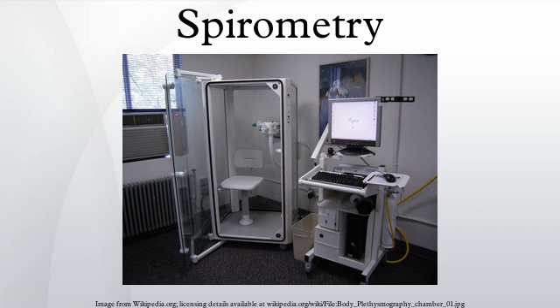Forced vital capacity. Forced vital capacity is the volume of air that can forcibly be blown out after full inspiration, measured in liters. FVC is the most basic maneuver in spirometry tests.